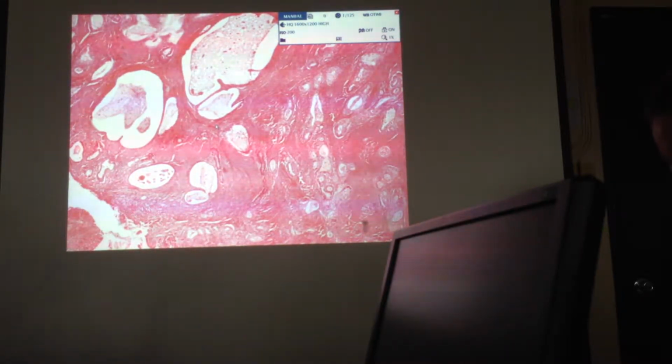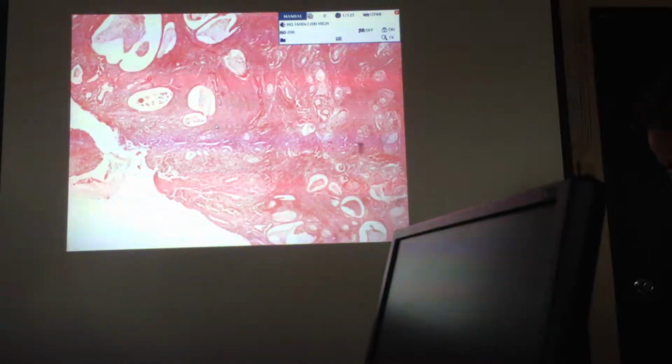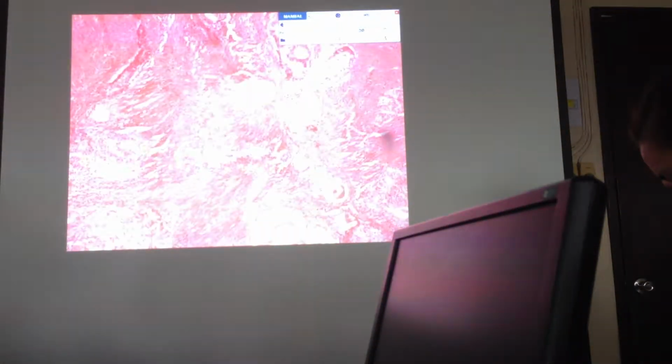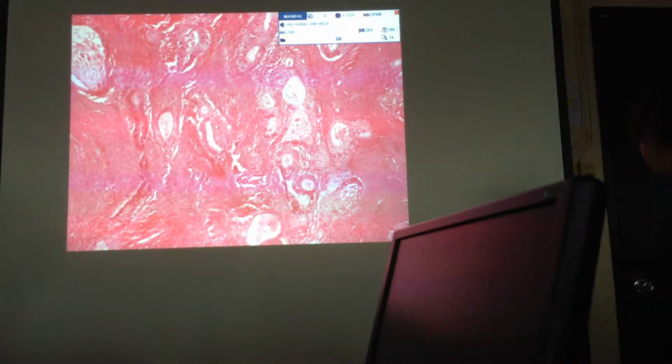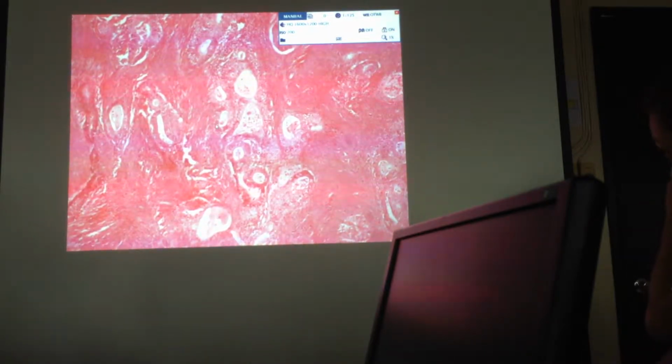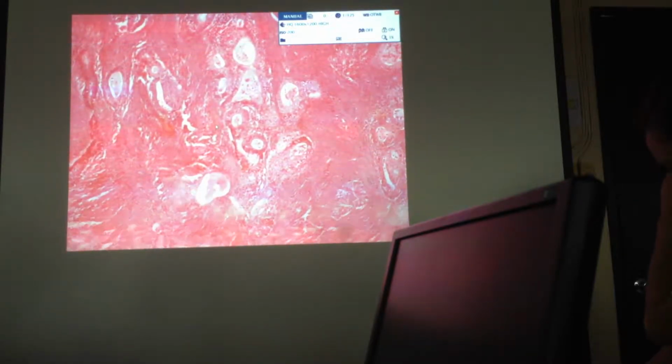Okay, so it's adenocarcinoma, endometrioid type. Okay, it's called endometrioid type because it mimics the appearance of the cells found in the endometrium. Okay? Yung columnar. Okay, so the typical appearance of endometrioid adenocarcinoma is that they are configured in back-to-back formation. Okay, some are fused.